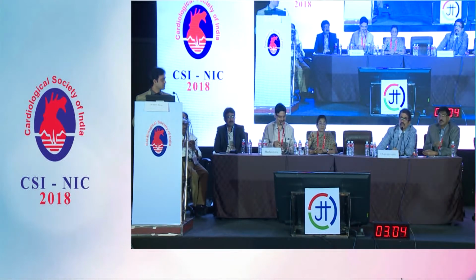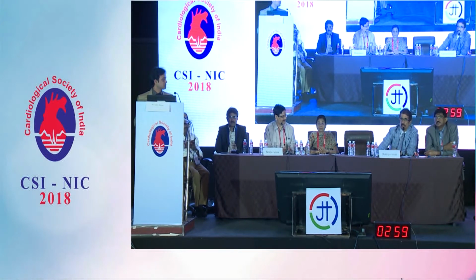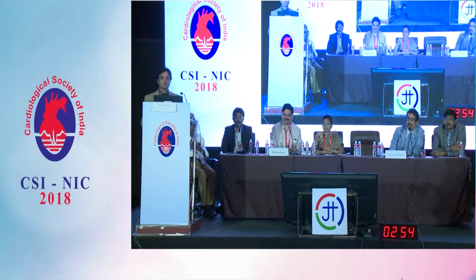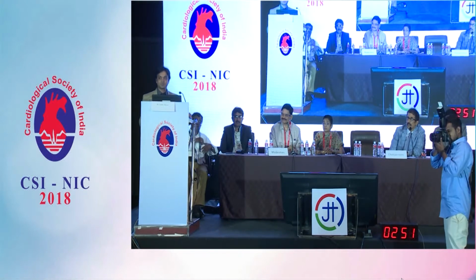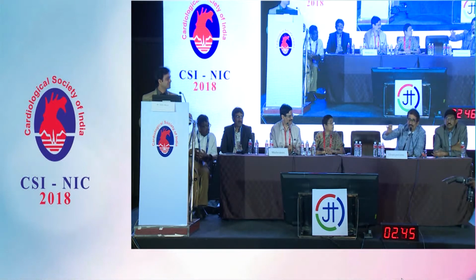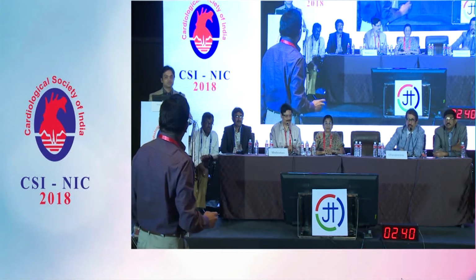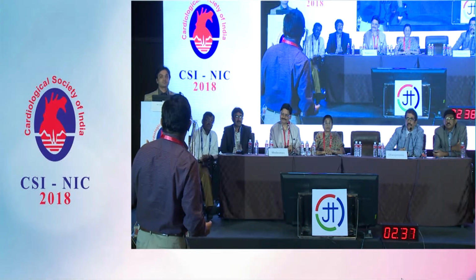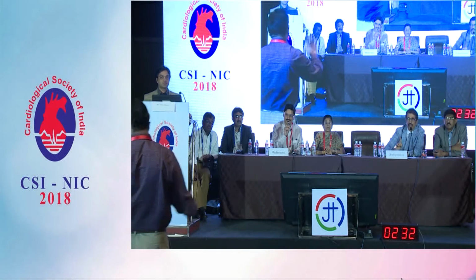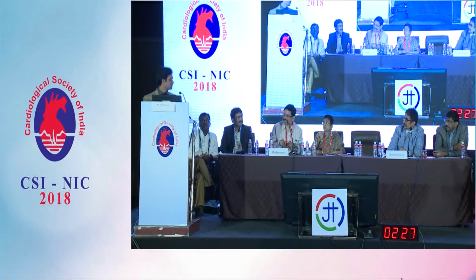But Pratap, I thought even when you do T, you bring the balloon back and have a kiss. So it's never that you don't kiss. Keep a balloon left. That may be the reason because of excess protrusion. No, but the audience should not go with the feeling after your comment that for T you do not need a balloon. For T also you need a balloon. But not the way it is planned. Once you protrude, you have to do final kissing in a TAP. That is the difference between T and TAP.